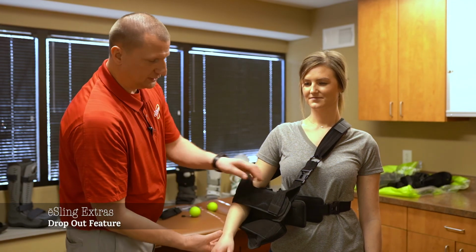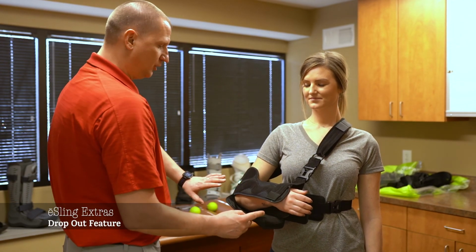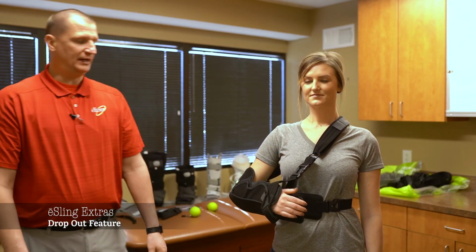Once they're done their program, they bring this back up to elbow at 90 degrees, elbow all the way back in the cradle, and then bring this back up and Velcro securely, and now they are back into the sling.